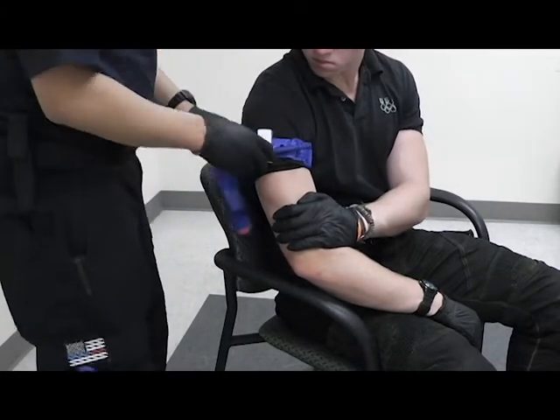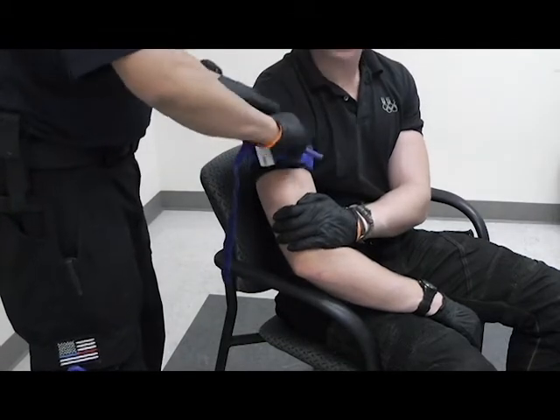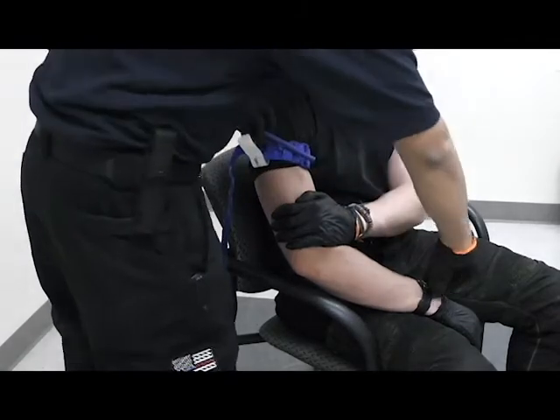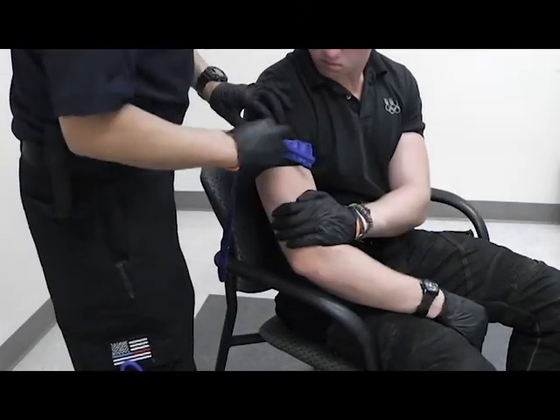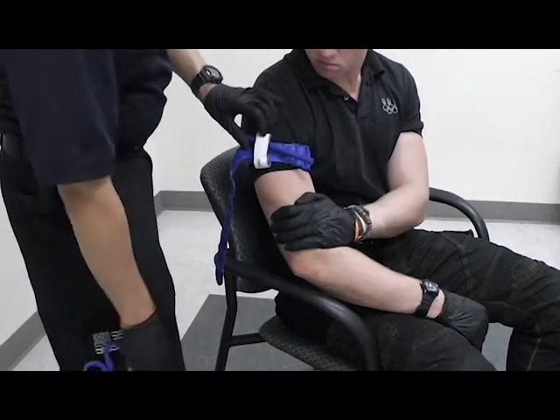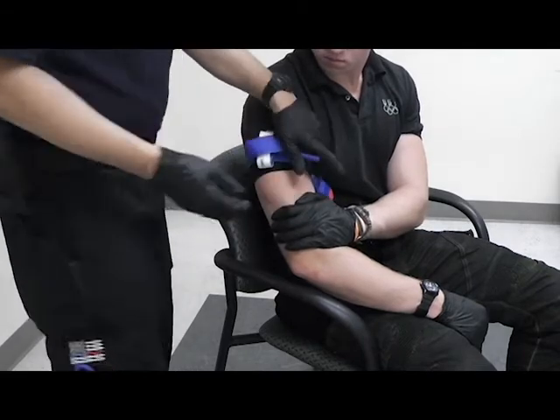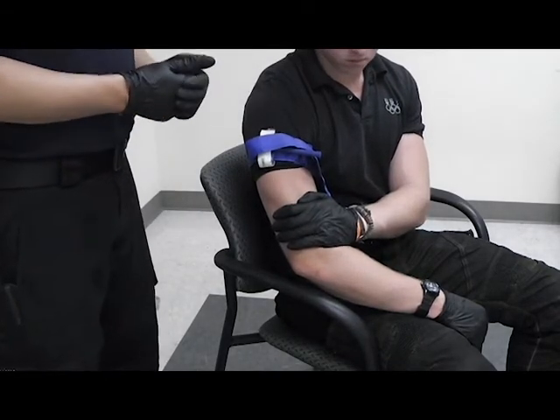Once my tourniquet is secure, I'm going to open this up, tighten my tourniquet down as much as possible, and then assess for pulse. Once my pulse is absent, I can then secure this, record my time that was applied, recorded on my paperwork, and then continue assessing every five minutes since this is a critical emergency.